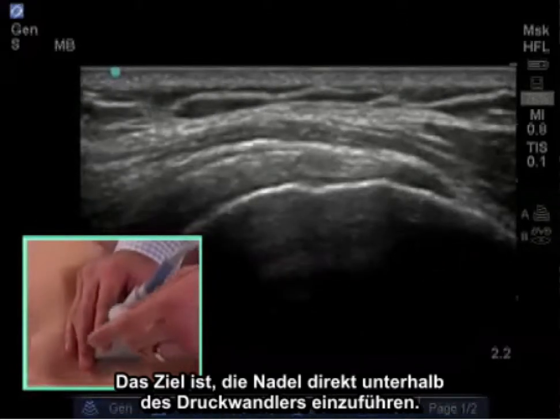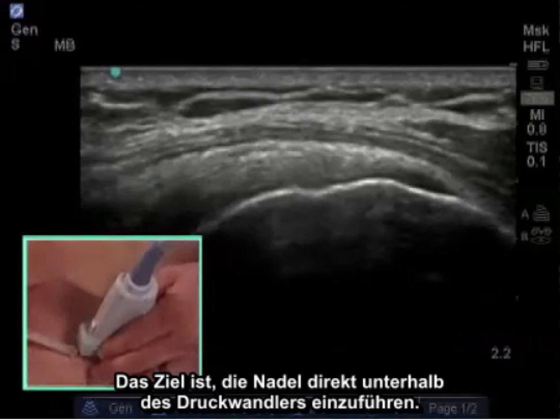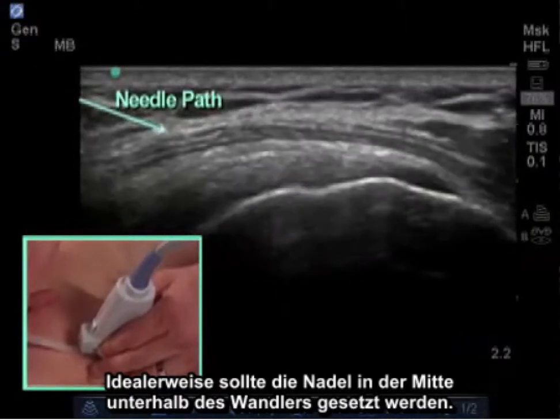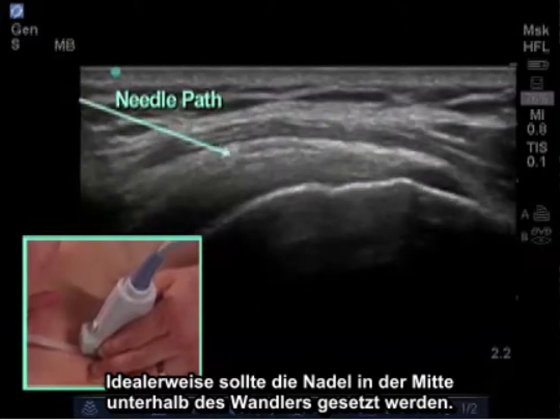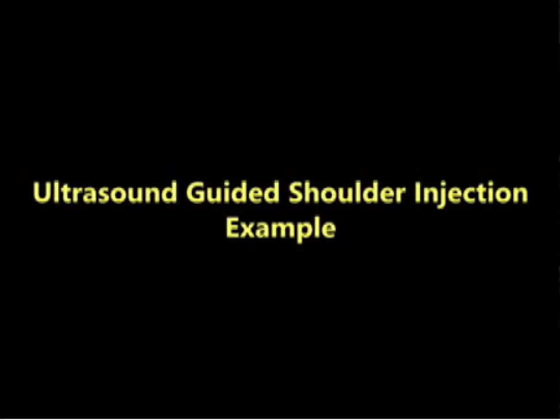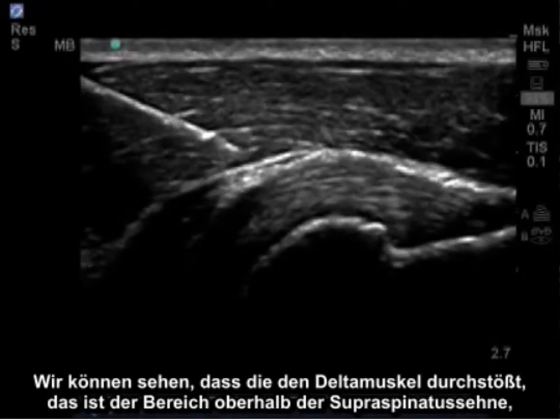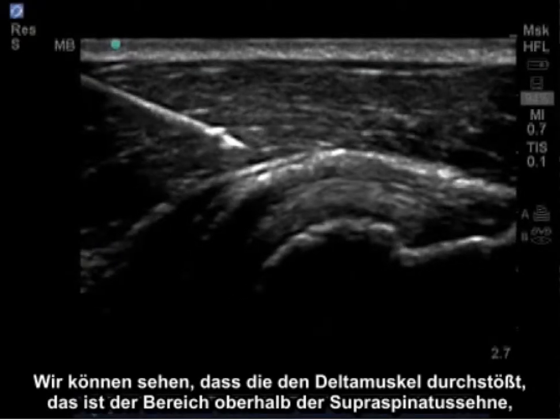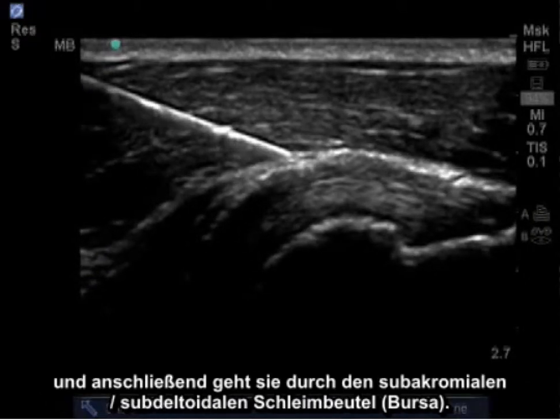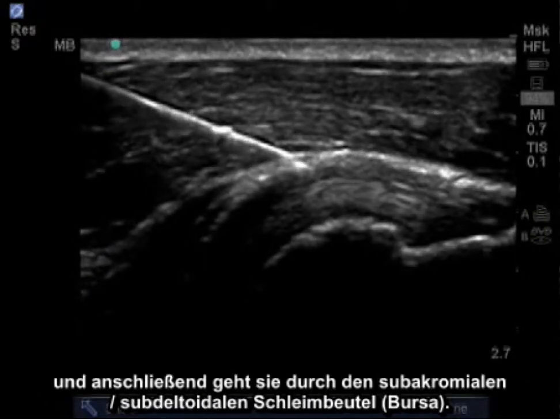The goal is to introduce the needle directly beneath the transducer. Ideally, the needle should be at the center point beneath the transducer. And we can see it penetrate the deltoid, which is the area above the supraspinatus tendon, and then it will penetrate the subacromial subdeltoid bursa.